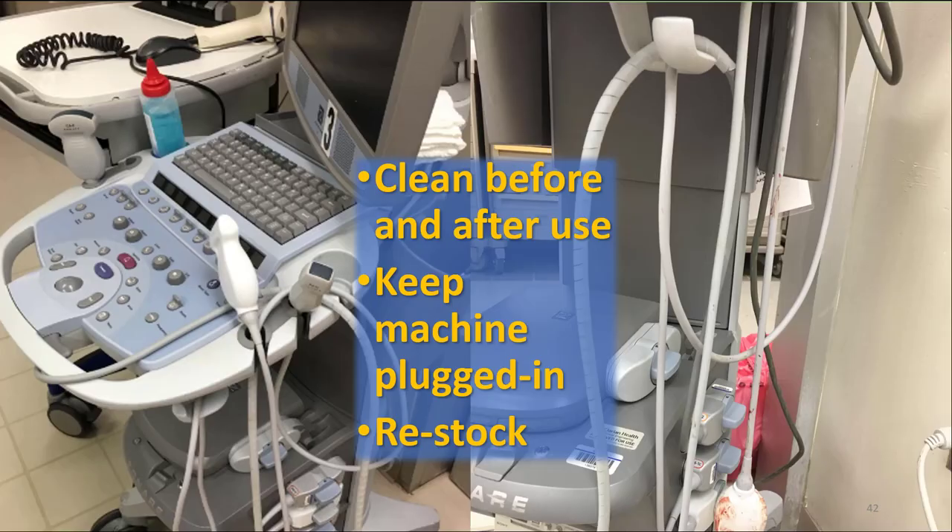When you're done, be sure to be a good neighbor and maintain the machines for the next patient and operator.